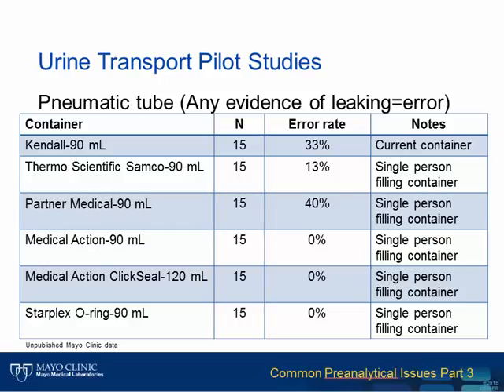Initially, we piloted a wide variety of containers, including the current one causing problems. You will note that even with the small number tested, some could easily be excluded from further consideration, and 3 were subjected to further studies.